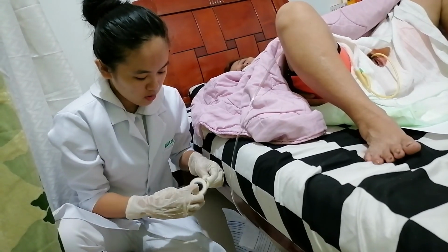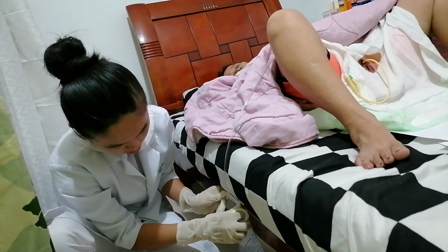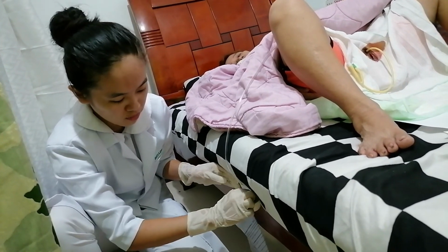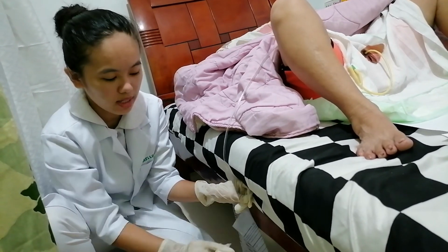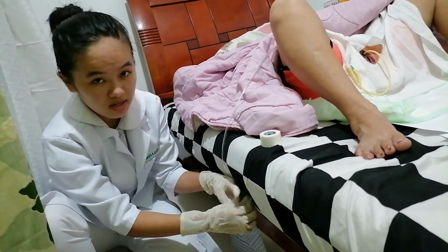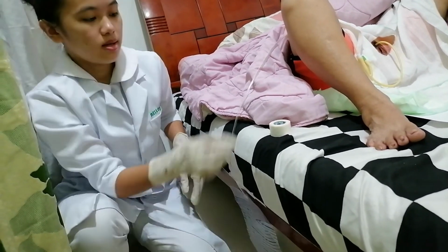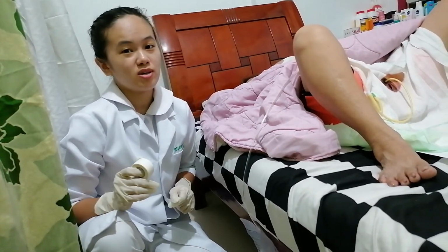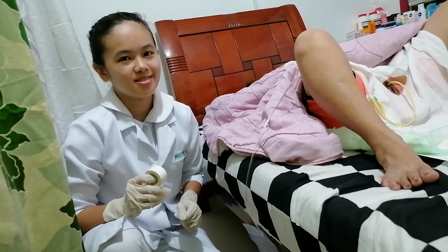And also, in the hospital, it should be placed away from any part that is movable, because if it is movable, it can easily be knocked over when the patient moves. So, we avoid that. So, I'm done. After that, I'm going to clean my area and wash my hands.